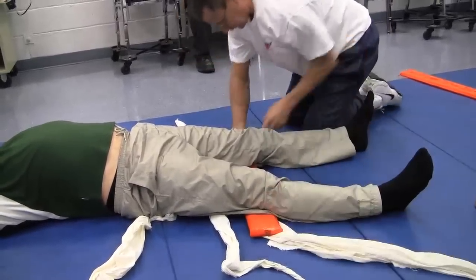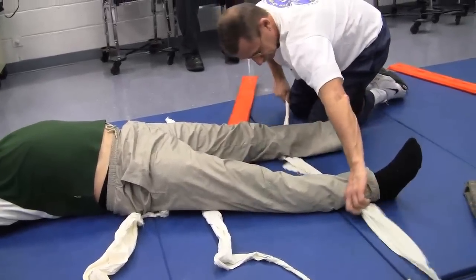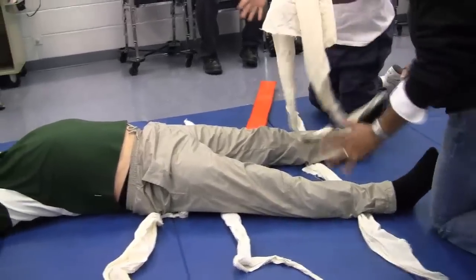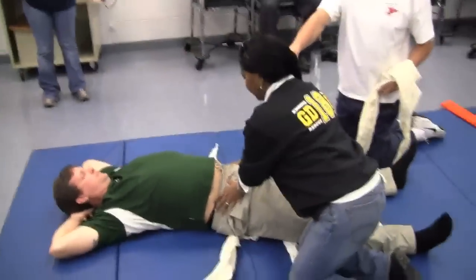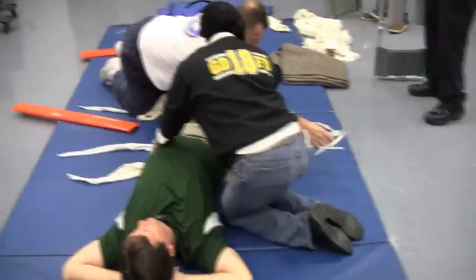Now, if I had a partner, my partner would be on his hips — on his hip side. There you go, right there. I'll hold it next to me. That's really good.